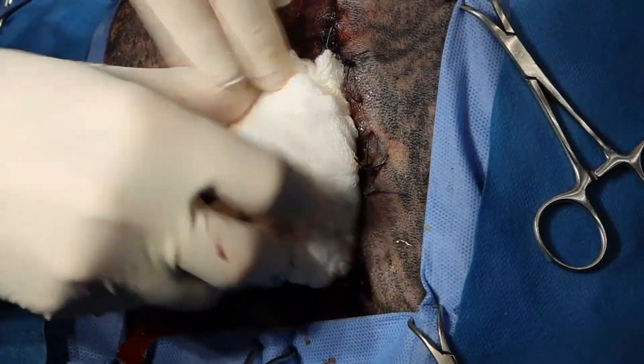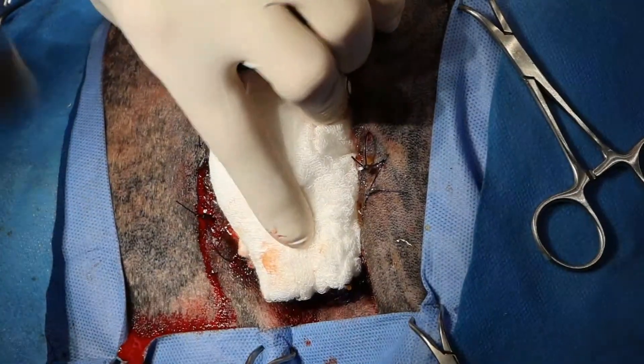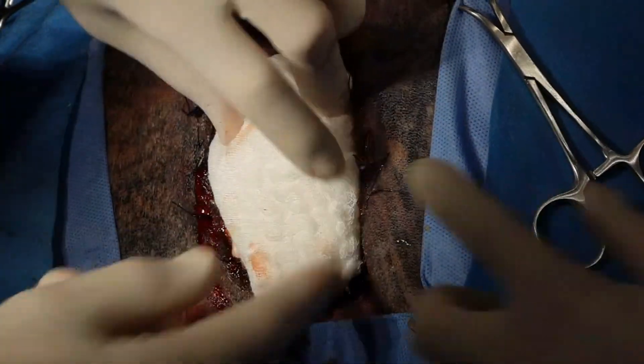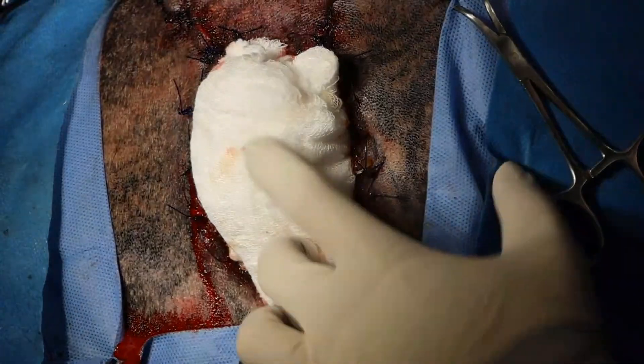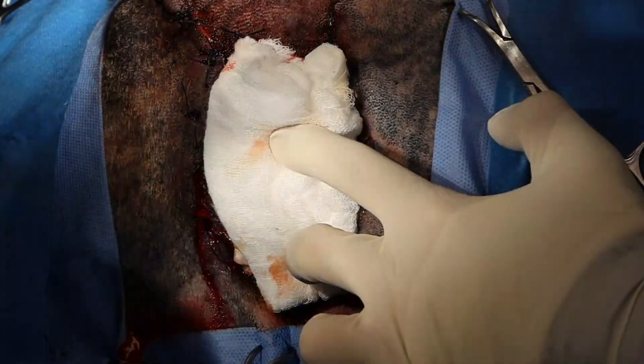I might get somebody to come around and just hold on to this — come around that side, just keep some pressure on that. And where is the umbilical tape? Here we go.